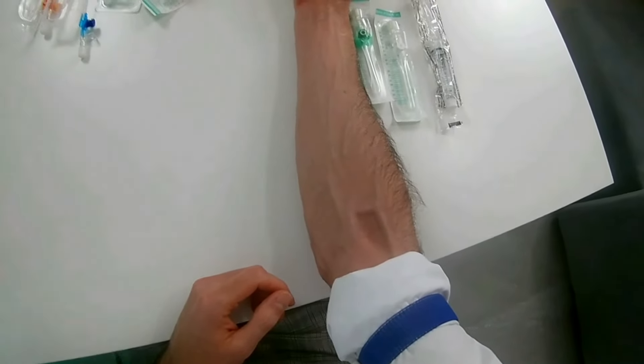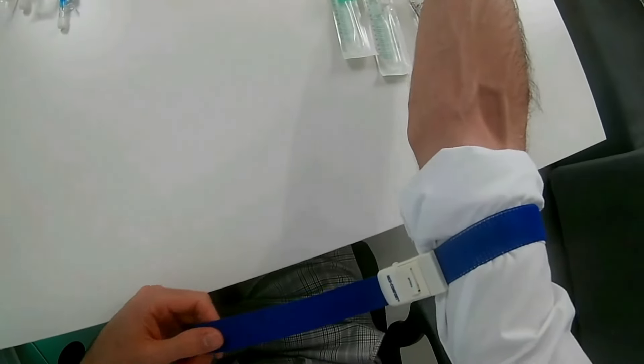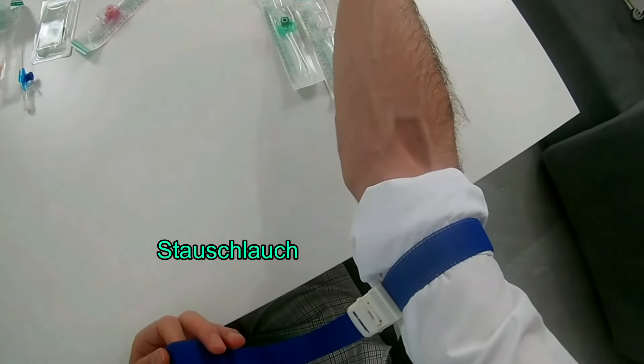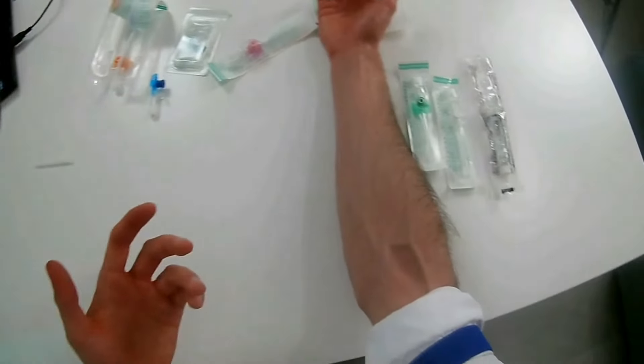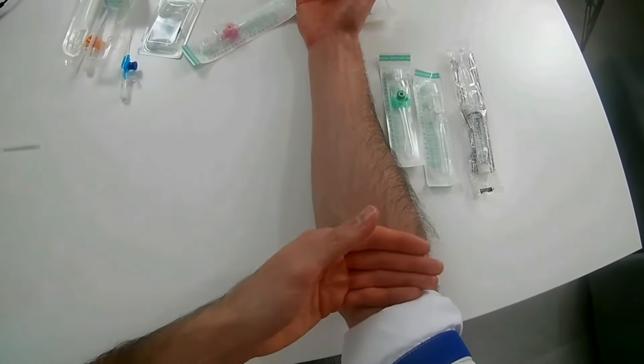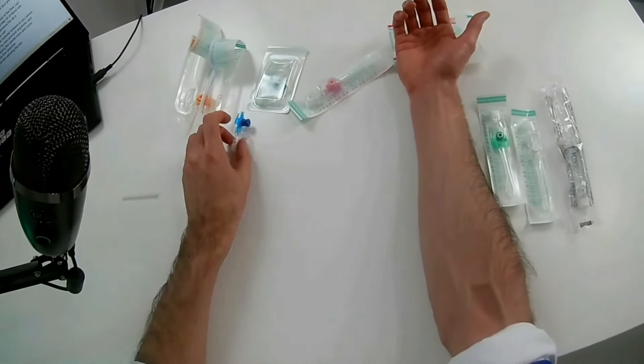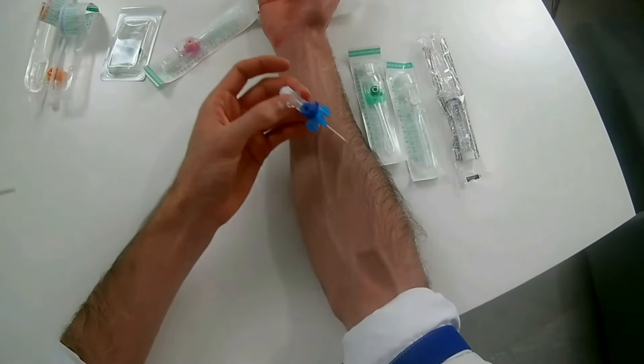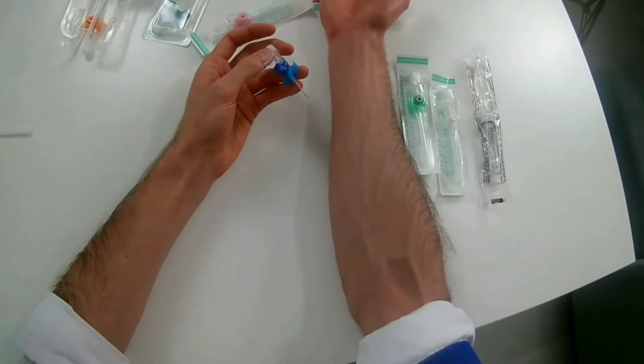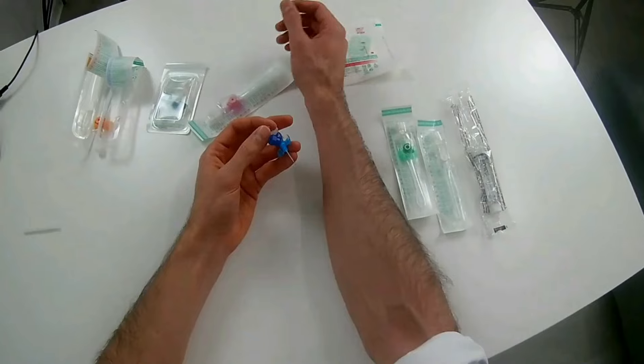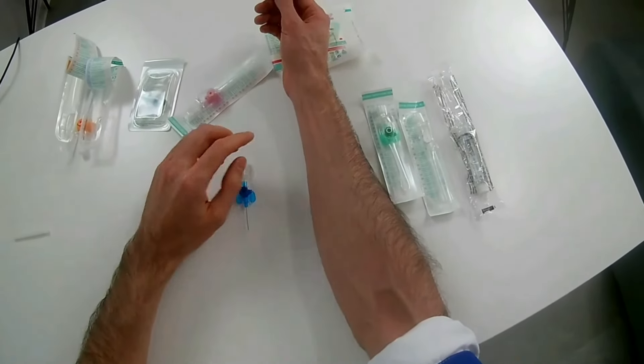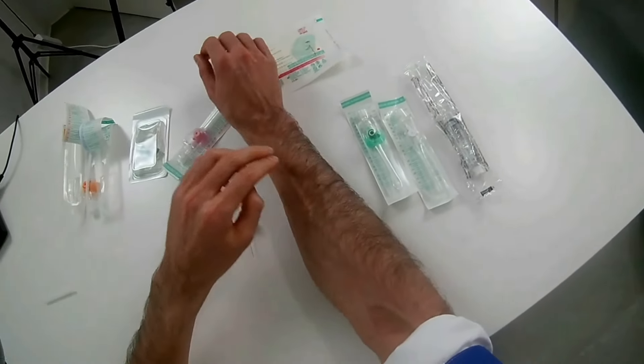So anyway, first of all you stop the venous flow with this. This would be called in Germany a Stauschlauch. And once the blood has already accumulated, you would take some Desinfektionsmittel, some spray of alcohol, and you would clean the part you would go in with a needle. Of course in my case it's not very difficult to find a vein. In other patients you might not see them, but you may be able to feel them with the fingers.